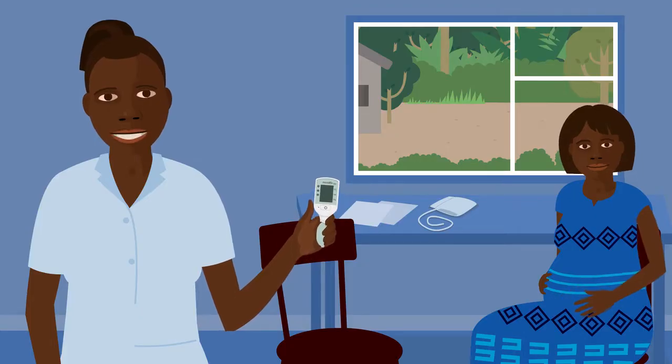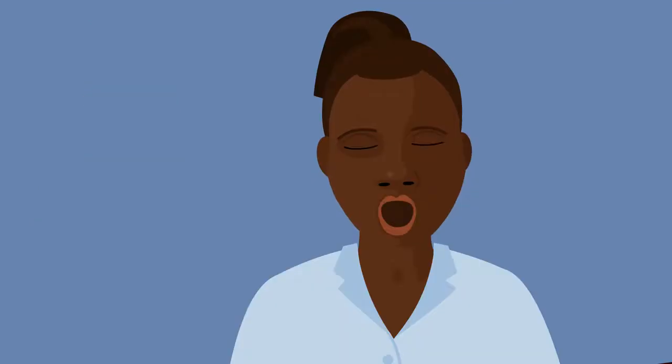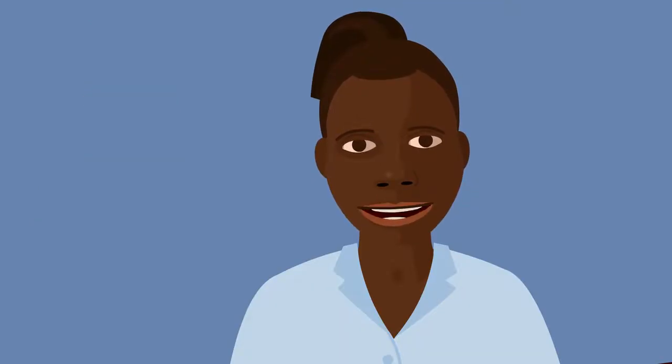All women should have these checks in pregnancy to make sure they're healthy. It's important to check the blood pressure and heart rate of pregnant women because the measurement can detect conditions that could cause the woman and baby harm.